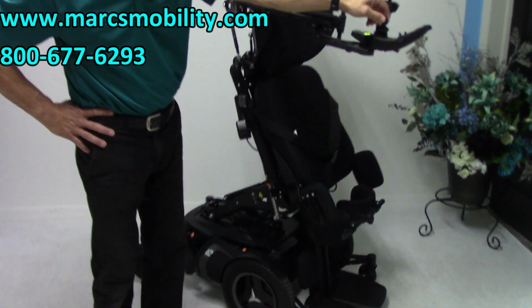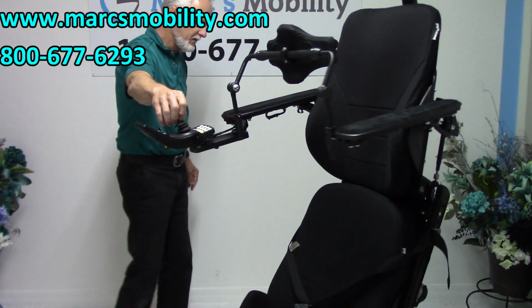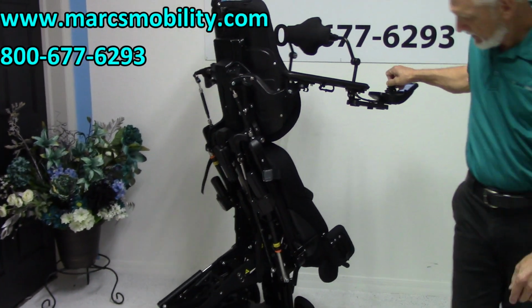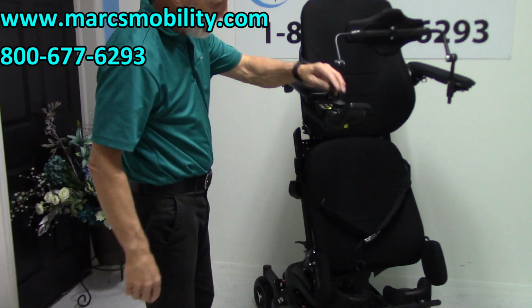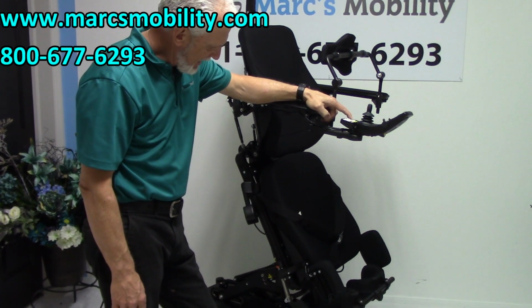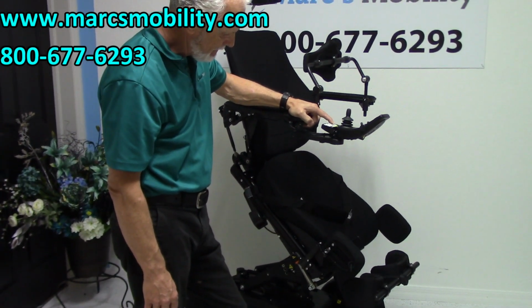And you can still drive the chair in the standing position. So I'm going to turn the chair around so you can see all of it. This is the back of the chair. And this is your standing position right there. So this is a great option to have. And when you bring it back down, you just hit the same button on the back side of it, and it'll start going backward. It'll bring the seat back down to sitting position.